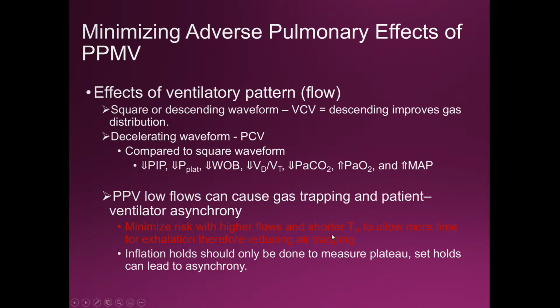Now this is on volume control. On pressure control, all we have to do is adjust the I time. That's it. Inflation holds should be only done to measure plateau. Set holds can lead to asynchrony. So again, make sure you understand your ventilator.